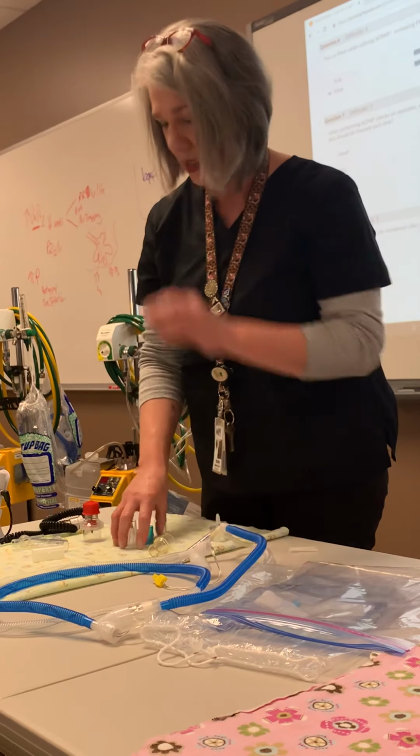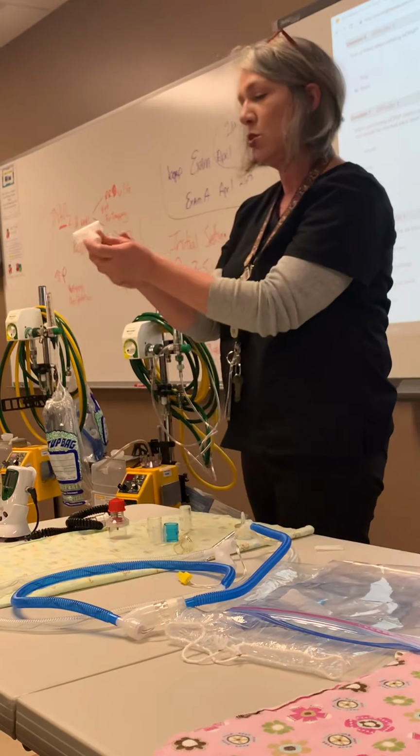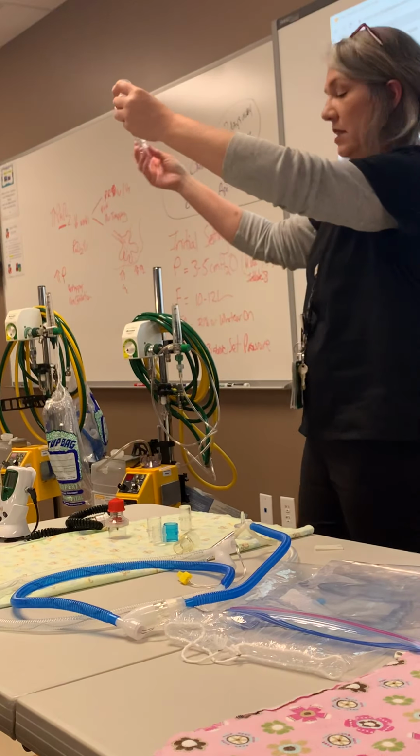What's next? T-pieces. T-piece adapter. So I need how many T-pieces? Two. I have several here again showing you different colors. Okay, same device, T-piece adapter.